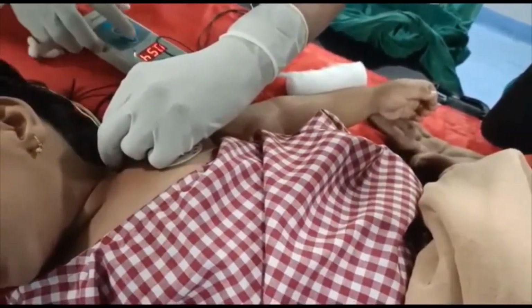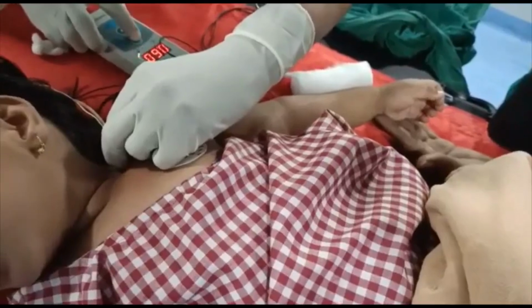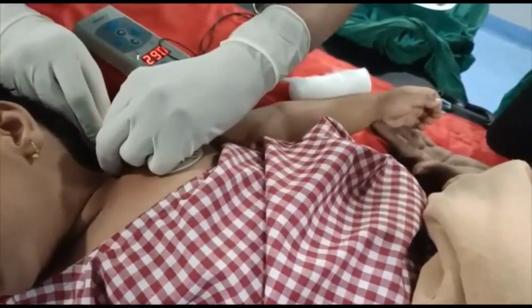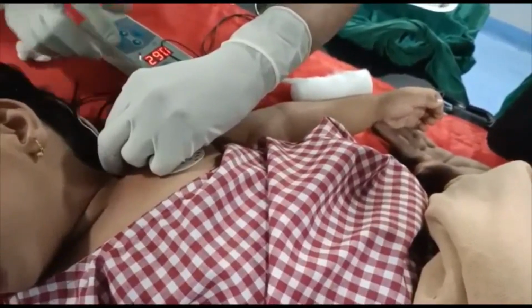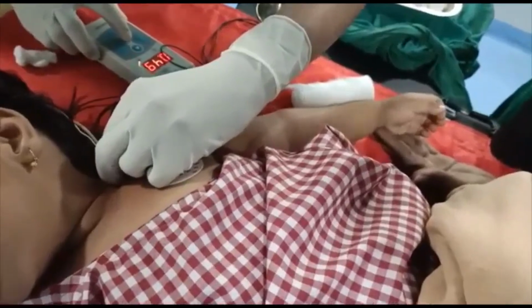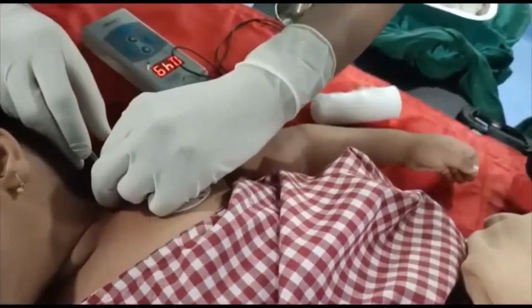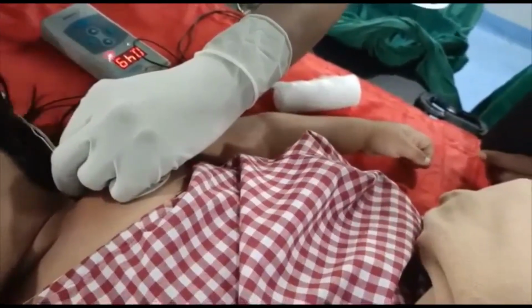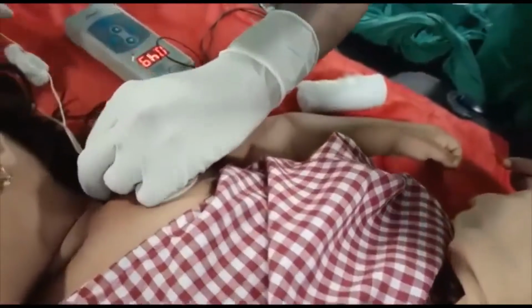Here the current was started at 1 milliampere, and then you have to look for contraction of the fingers, either the extensors or the flexors. Gradually the current is decreased, so that contraction of the fingers is seen at less than 0.5 milliamperes. Here now you can see the contraction of the fingers at 0.49 milliamperes. Now we can do the injection.